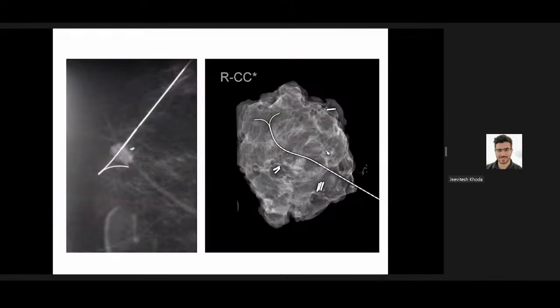So this is the other cap-on one which I said, which is a single hook. It has a slightly higher tendency to get displaced in my experience, and this is how it looks once it's deployed. And like I mentioned earlier, here there is a complete response around this fiducial marker. So once the specimen reaches us, you can see that there is quite a bit of displacement of the wire tip from the marker where it was originally put, just because there was not a good solid anchoring for the wire. It moved a lot, so this can happen.